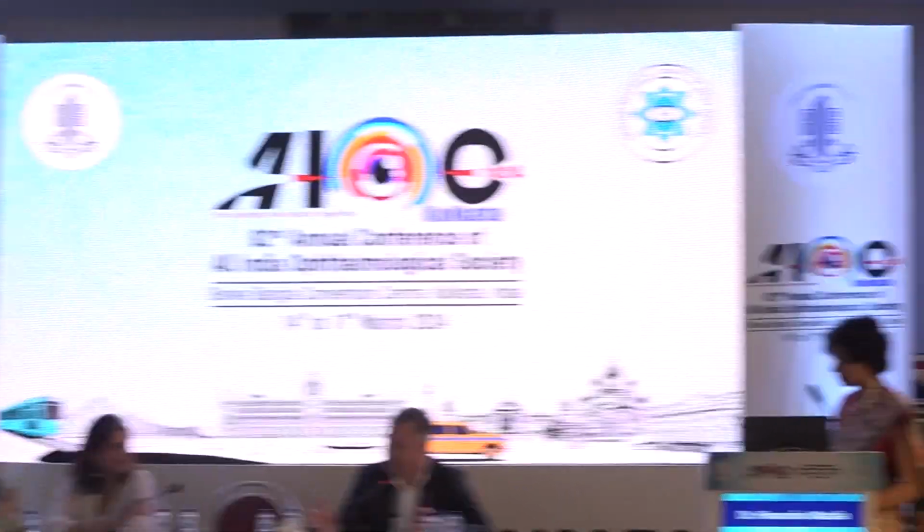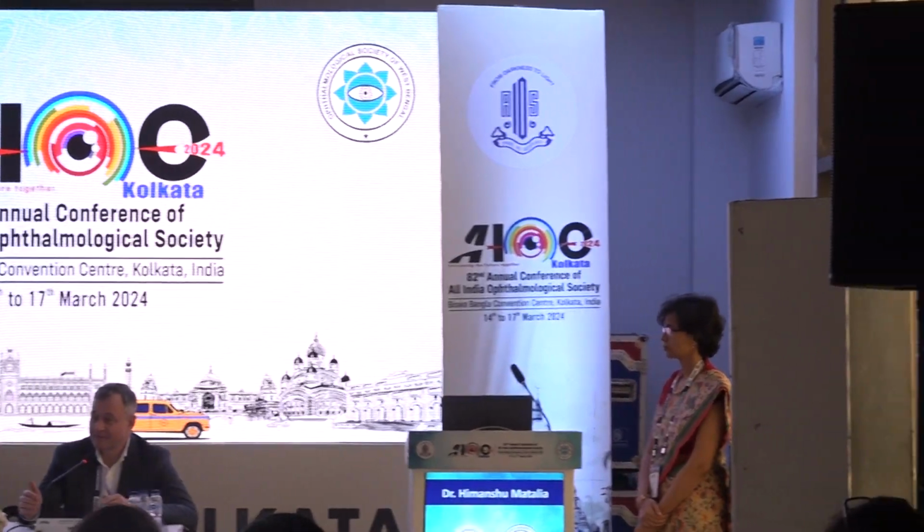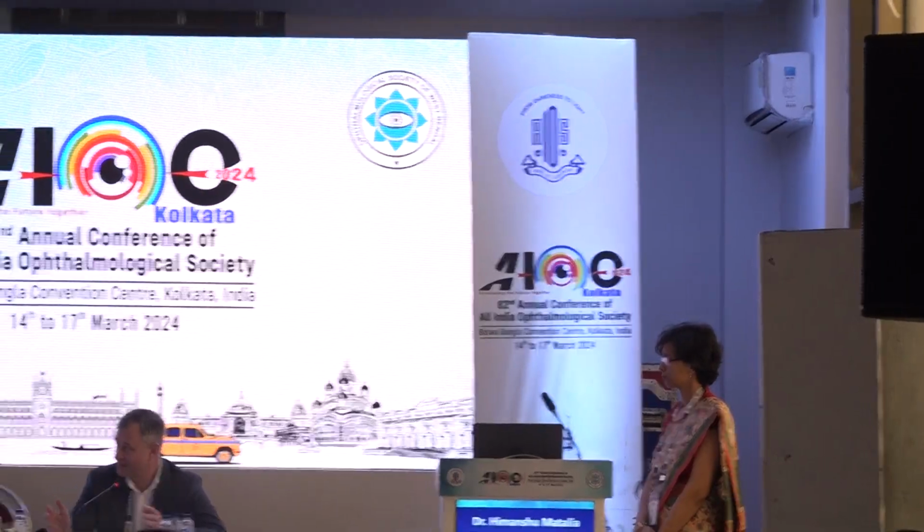Although I know that when you have a big giant tear, and this is a phakic eye, and you place air or gas into the anterior chamber, at least in my hands it is not infrequent to expect Urrets-Zavalia syndrome because of the pressure. Any special comments on that? How would you avoid this issue that is not infrequent in this case?